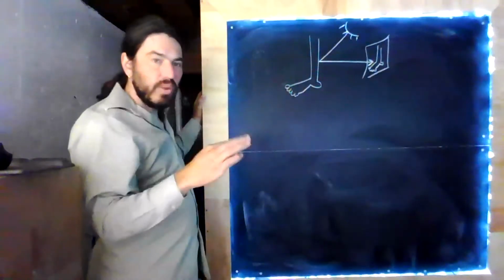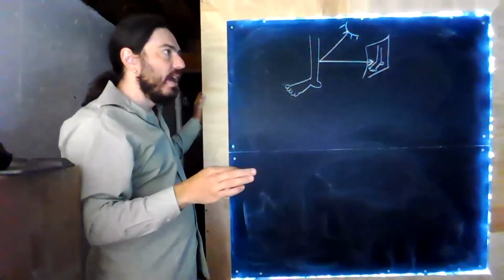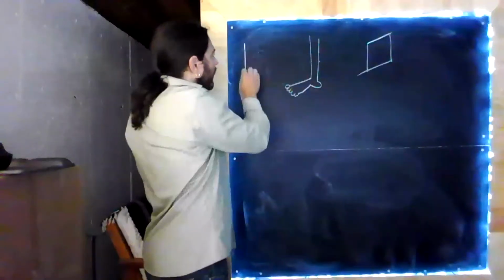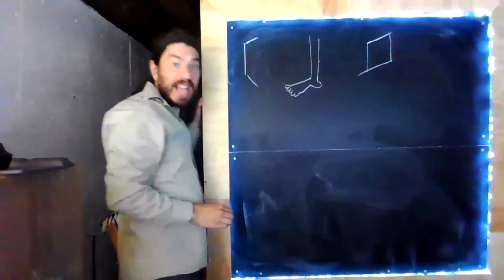Let's compare that with the way that an X-ray works, for example. So if instead of regular photography here, we were working with an X-ray, well, it's similar in that we still have a piece of film over here, but it's a little bit different in that I now shine my light from over here, and it's not exactly light, it's X-ray, some X-ray source.